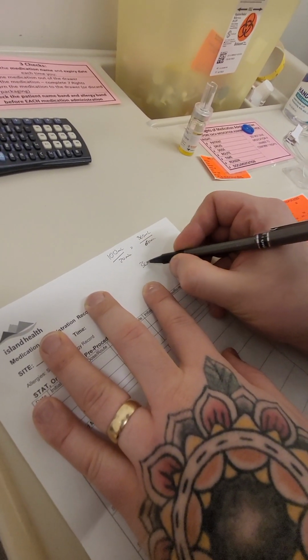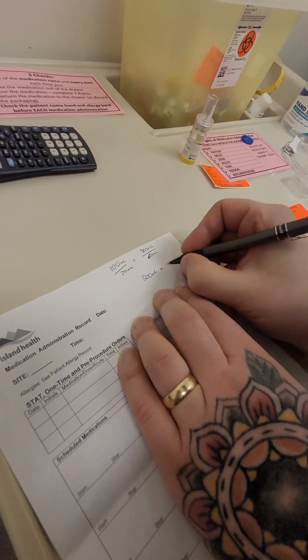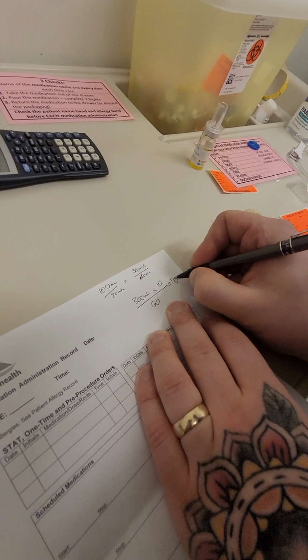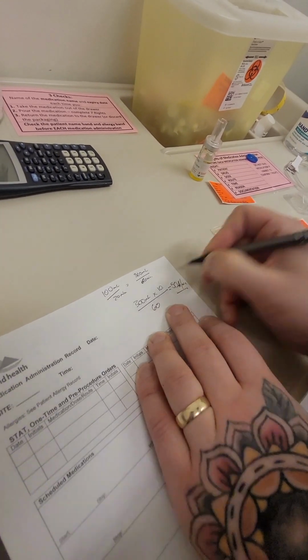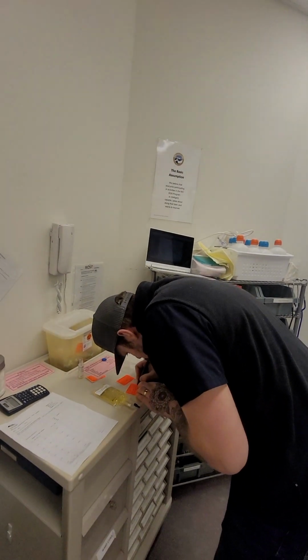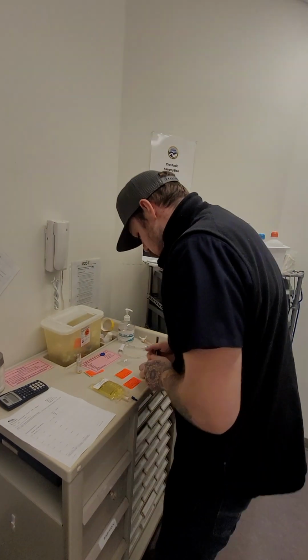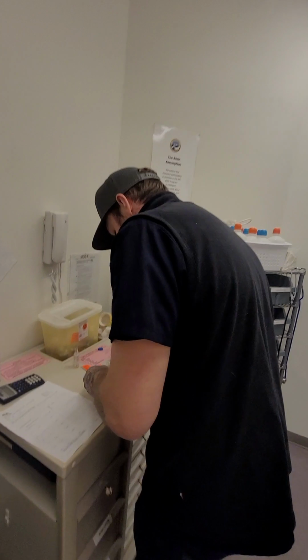So we've got 300 milliliters times our drop factor, which is going to be on our secondary IV line. That's 10. Divide by 60. That gives me 50 drops per minute. So that's going to be our flow rate. So we can go ahead and put this on here as 50 drops per minute. And that will infuse 100 milliliters over 20 minutes. So we've got this. Go ahead and place that.